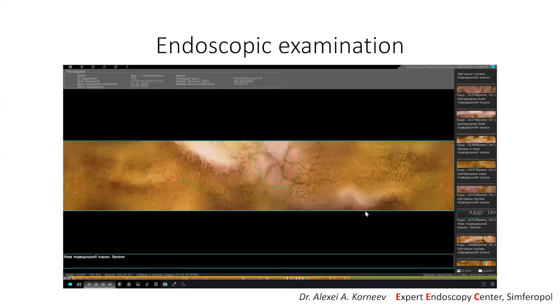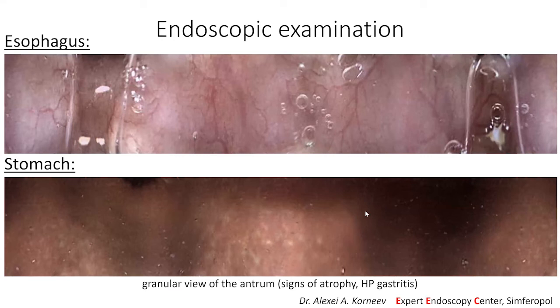Analysis of the study takes place in a special program, CapsoView. I think that for most doctors, it will not cause difficulties. Let's look at the resulting images. Despite the fact that the patient swallowed the capsule while lying on his side, we received 17 images of the esophagus in 7 seconds. In the stomach, the capsule was a little less than 4 minutes and gave us very clear images of the distal part of the stomach.